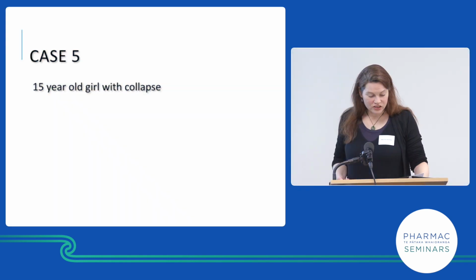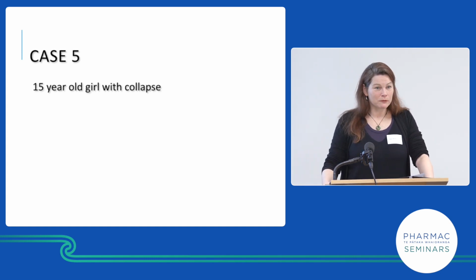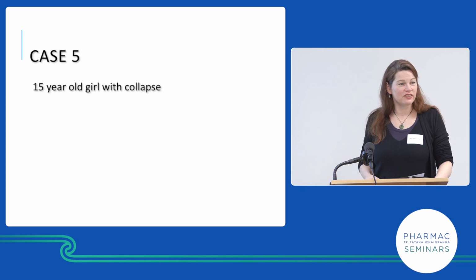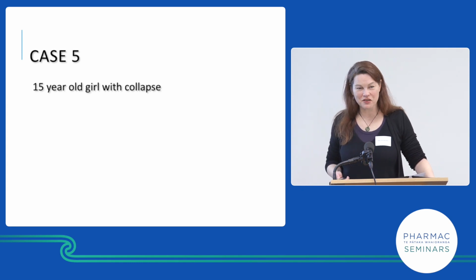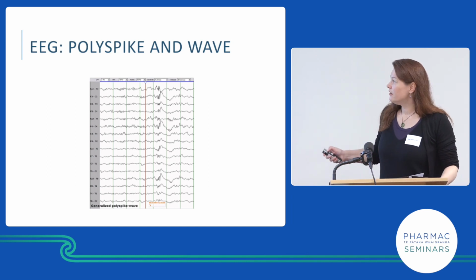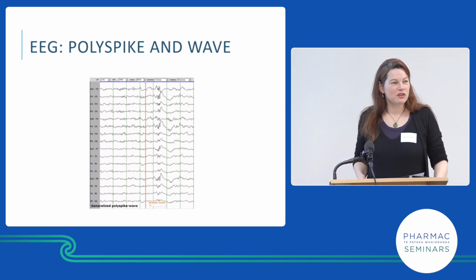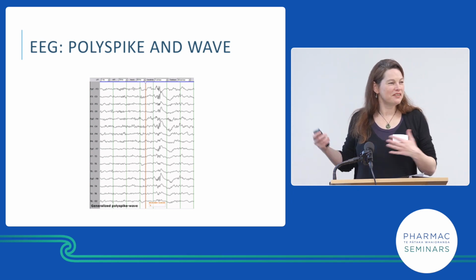The last case for that session is a 15-year-old girl with collapse, and I'll just tell you that she's had a seizure. So I'll talk a little bit about seizures now. And this particular girl has this EEG. So I thought I'd show you an EEG because you've maybe never seen an EEG. But this is what an EEG looks like.